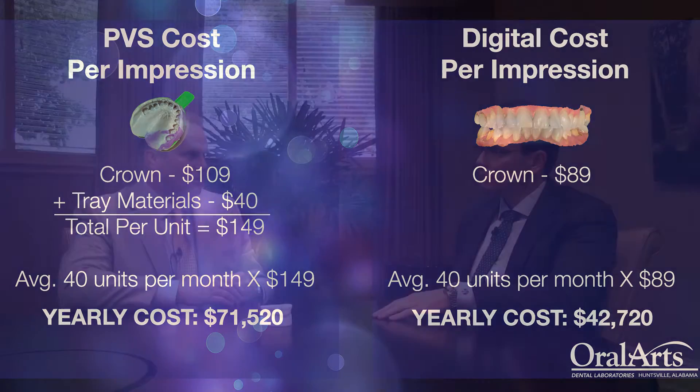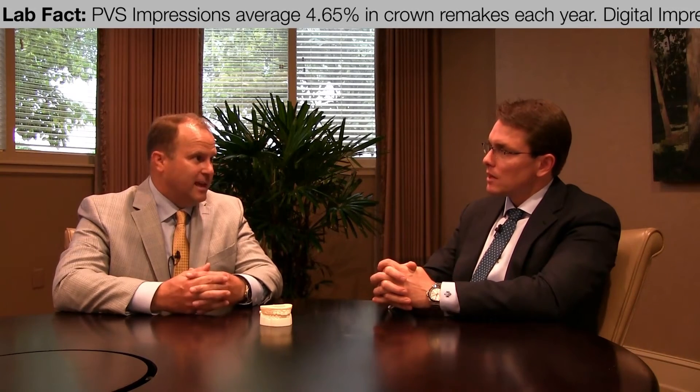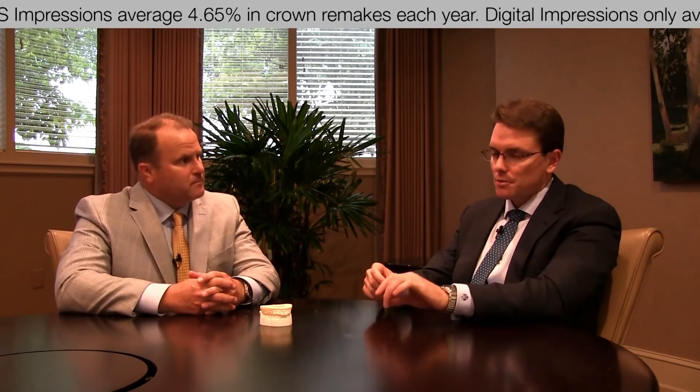The scanner would pay for itself in two years if you're doing 40 crowns a month, which is what the average dentist does. We do about 80 a month, so we would pay for it in one year with the savings on polyvinyl siloxane and the discount we get from Oral Arts for doing modelless crowns. And that's not including our time factor as well, because we're much quicker, more efficient, and our crowns are more accurate with the scanner.